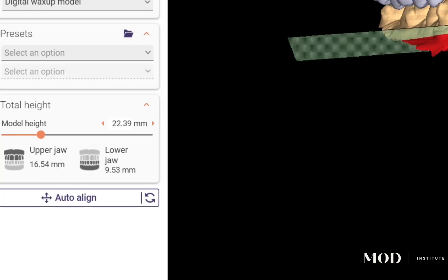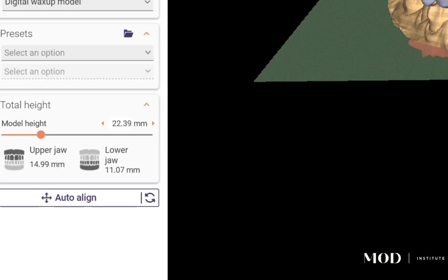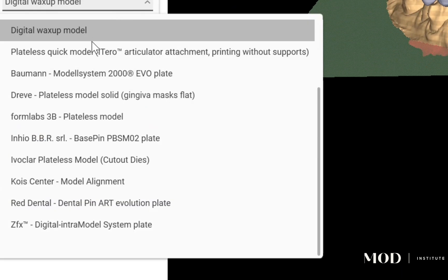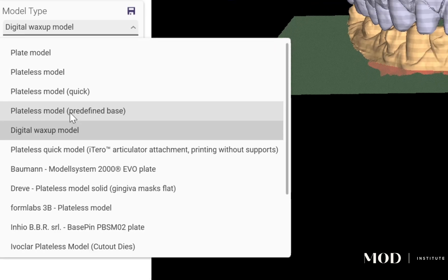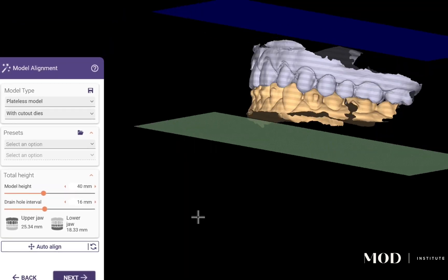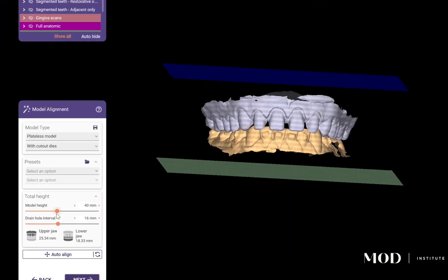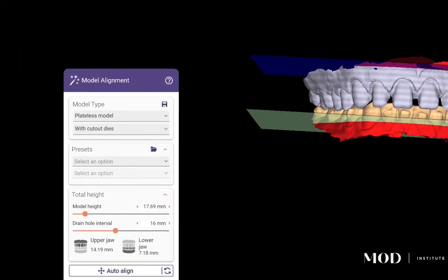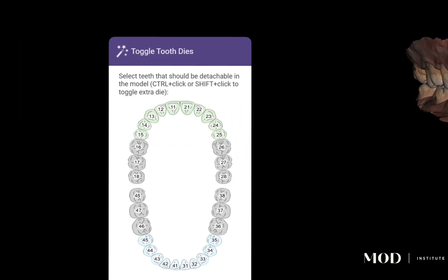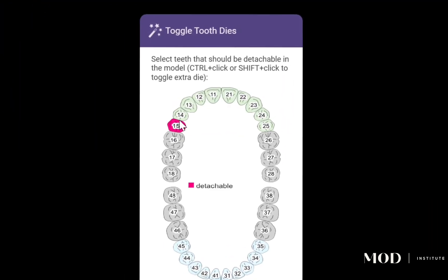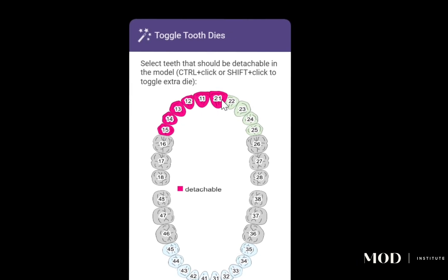Now we're in the model builder tool. The first thing you want to do is hit the drop-down menu, select 'plateless model,' and then alter the height of your model by dragging the slider.